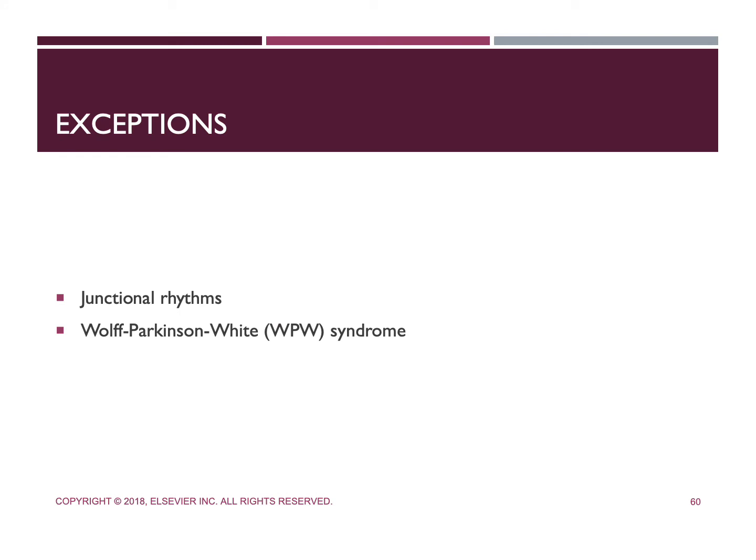So the criteria used to recognize a bundle branch block are valid, but they do lack some sensitivity and specificity. So the sensitivity can be limited by junctional rhythms because there may be no discernible P waves when the AV junction is the pacemaker site. The AV junction is a supraventricular pacemaker, but this presents as an exception to the two-part rule of the bundle branch block recognition.